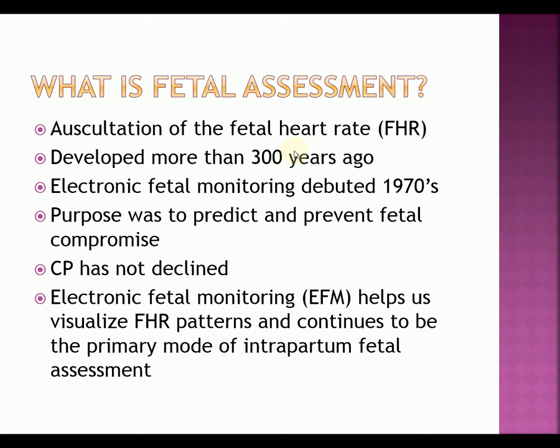Since we've been using it, we have determined what fetal patterns are, what they mean, and what causes them. So it continues to be our primary mode of intrapartum monitoring.